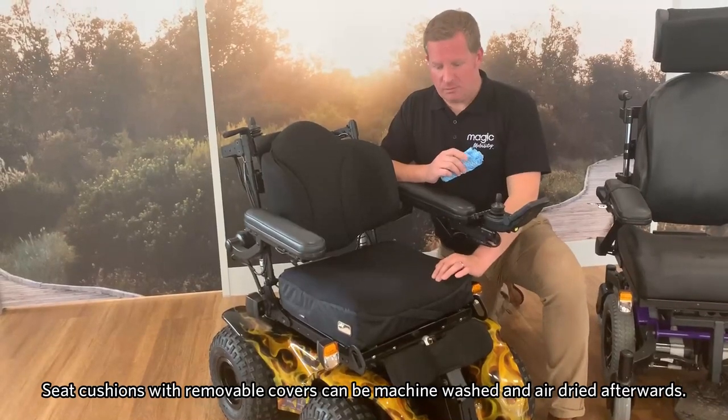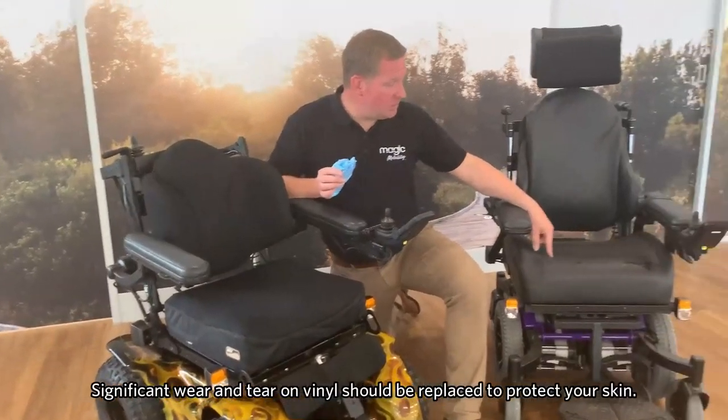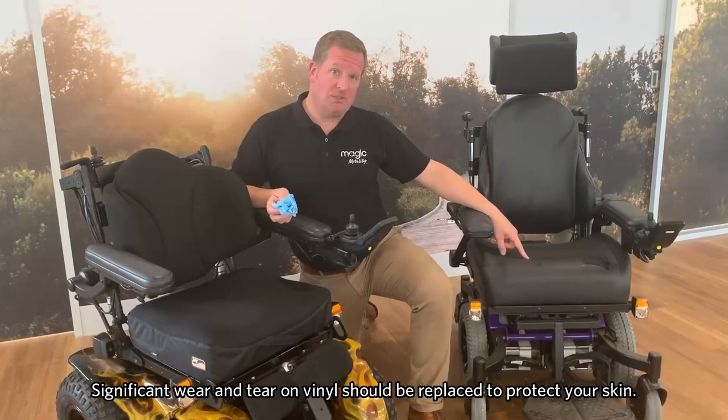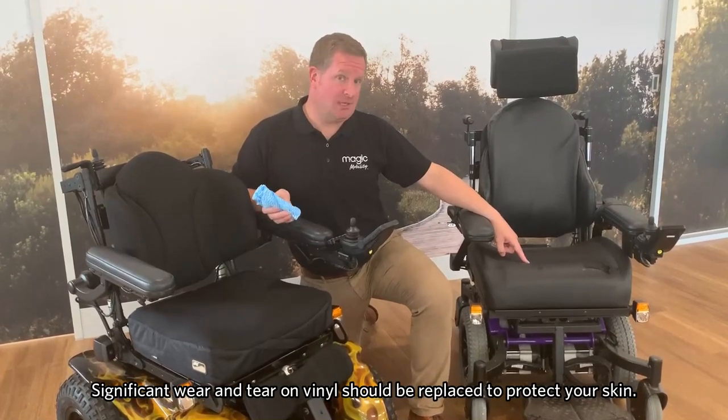In the instance of this cushion here, it has a removable cover which you can put through the washing machine and let air dry afterwards. Moving to the seat cushions, be mindful that if there is any significant wear and tear on these cushions, you really need to replace them to protect your skin.